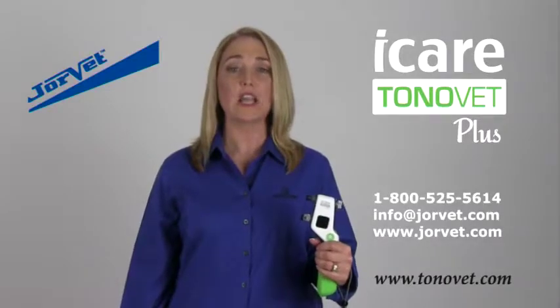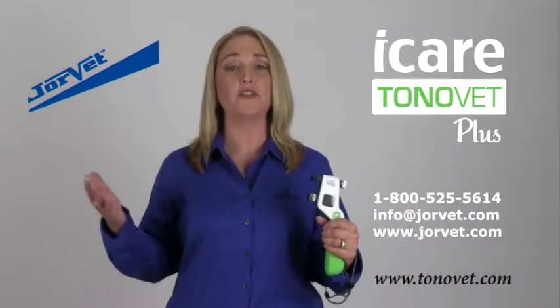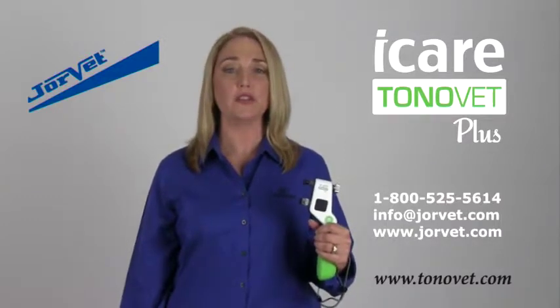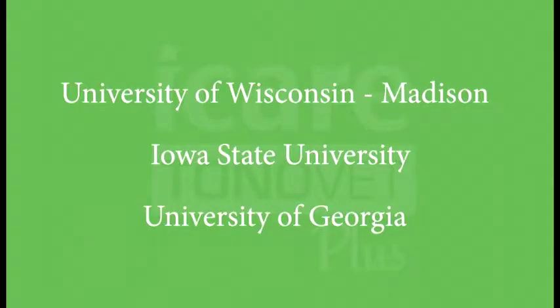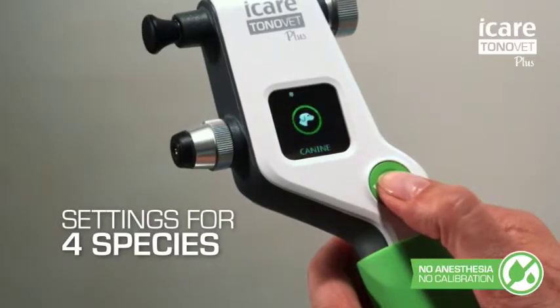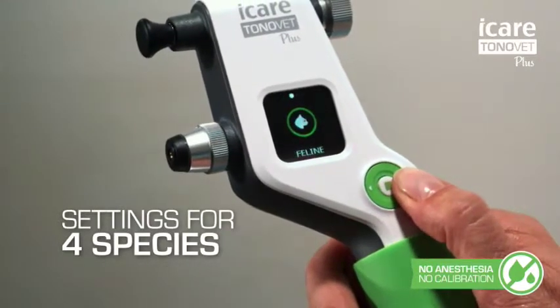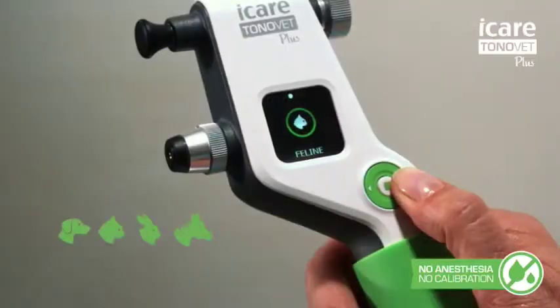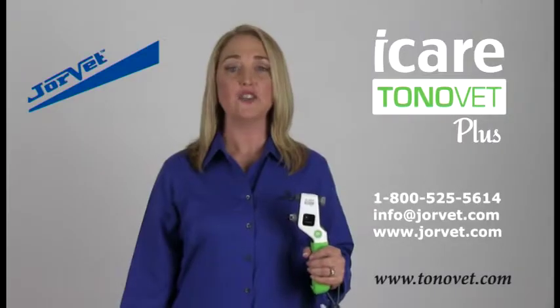The ToneVet is the only tonometer that is calibrated for animals. With the ToneVet Plus, we have improved the accuracy through extensive research with partnering universities. This research, combined with software improvements, has allowed us to create four settings: one for cats, dogs, rabbits, and horses.